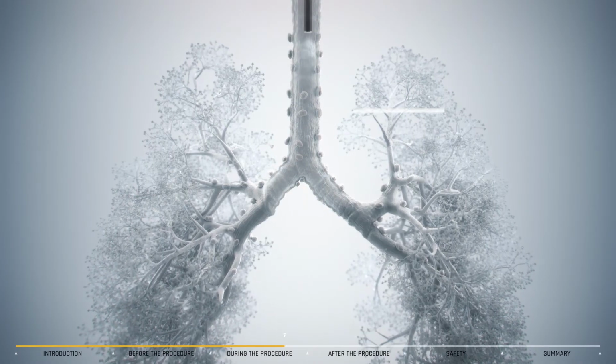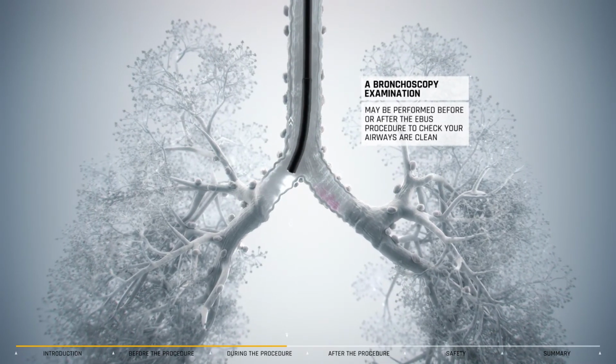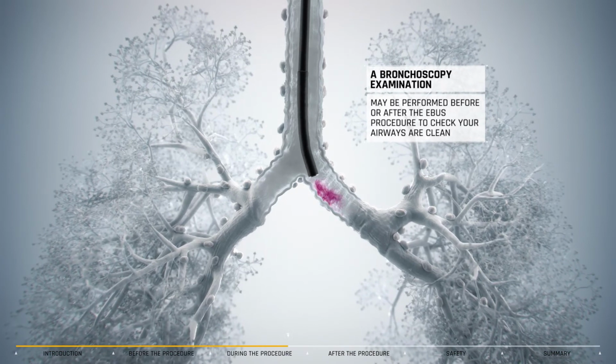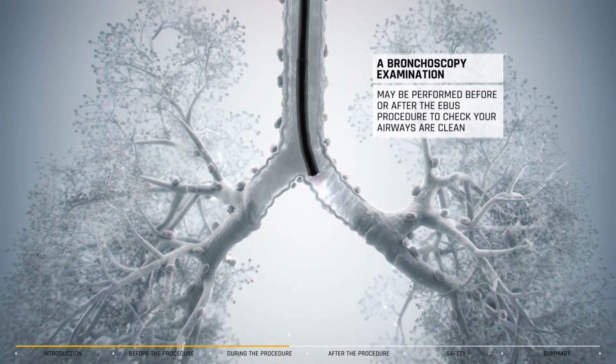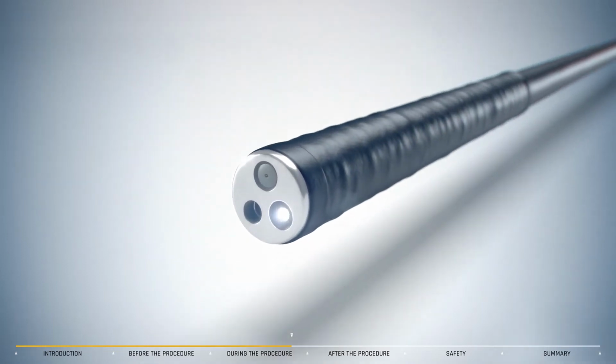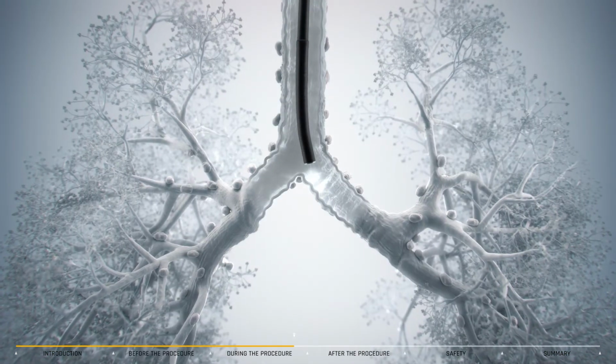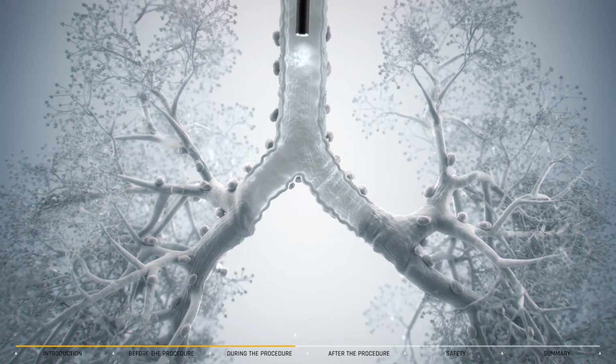Many operators also perform a bronchoscopy before or after the EBUS procedure to check the airways and to remove any mucus or blood from the airway using suction. The bronchoscope is a tube similar to the EBUS scope that has a light at the end and is placed in the mouth and airways. This part of the procedure usually only takes 5 minutes.